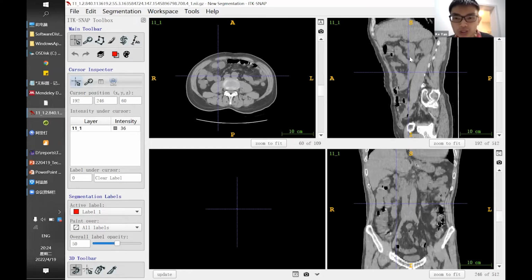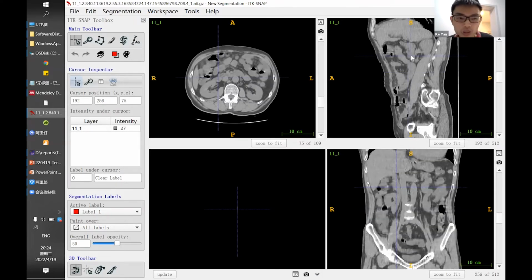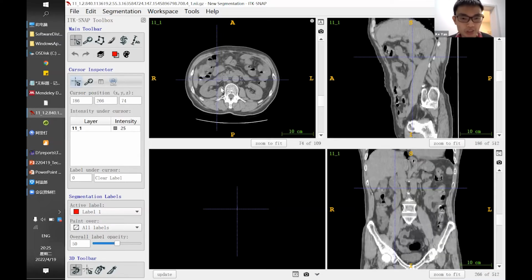Given a point, we want to know what z coordinate it is. For example, this may be 0.3. But all of our data is on 2D slices. If you only give the model this 2D slice, the model doesn't know how far it is from the foot and from the head, so it doesn't know how to compute the z coordinate of this point on the image.